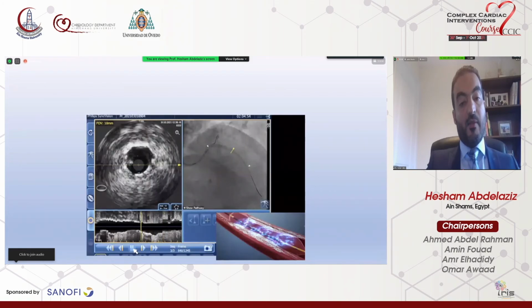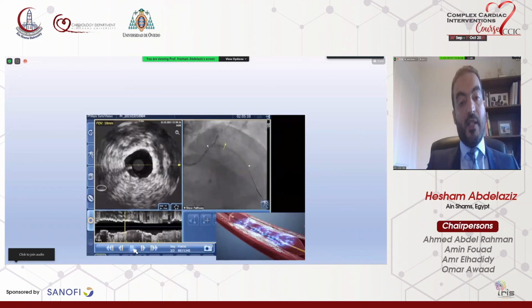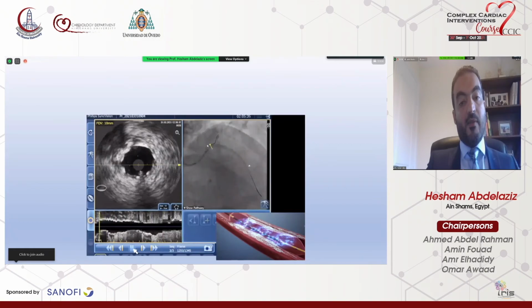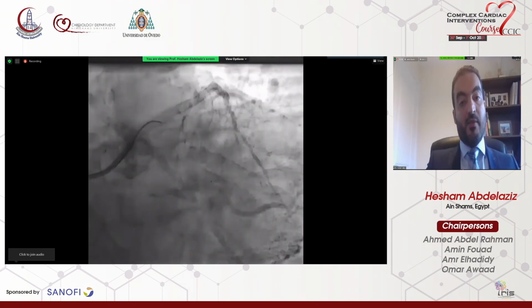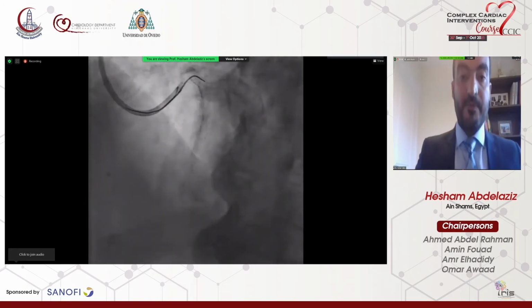showing on the longitudinal section, you can clearly see the well expanded and apposed stent back to near the left LAD ostium. And these are the final documentary images. Compared to the initial images, this is a satisfactory outcome.